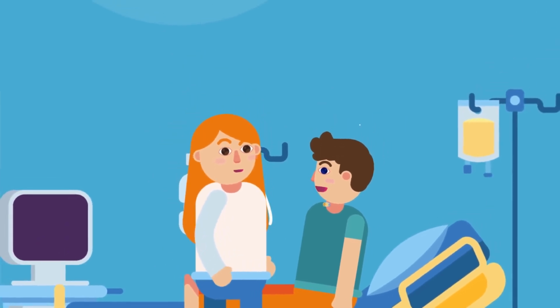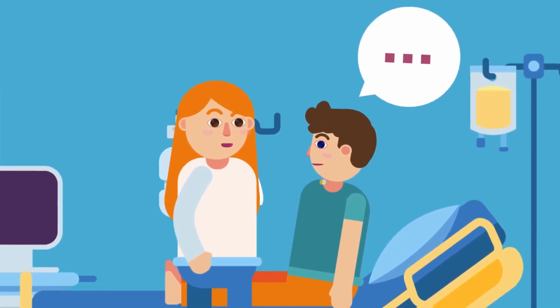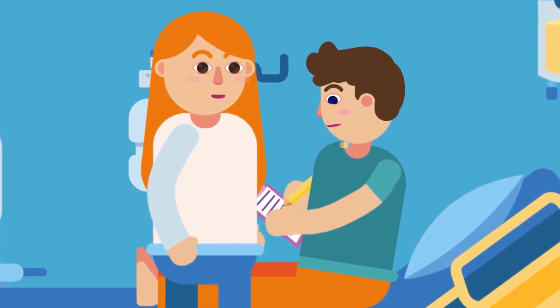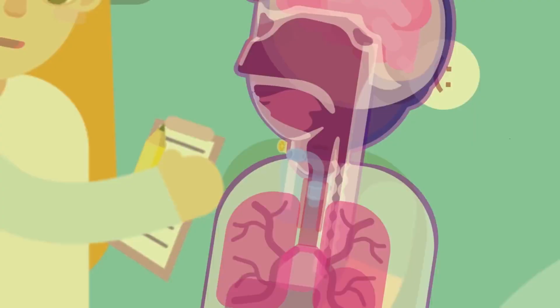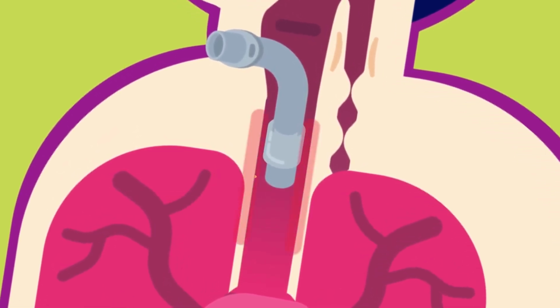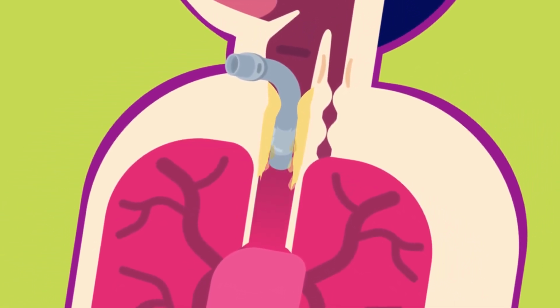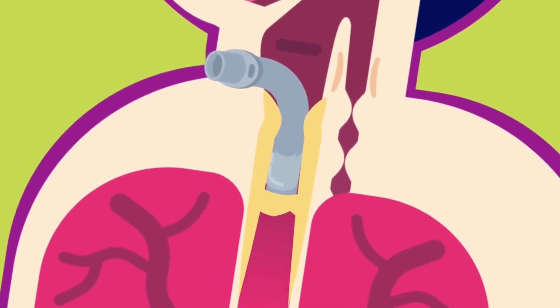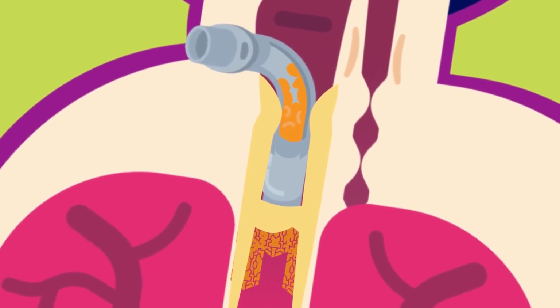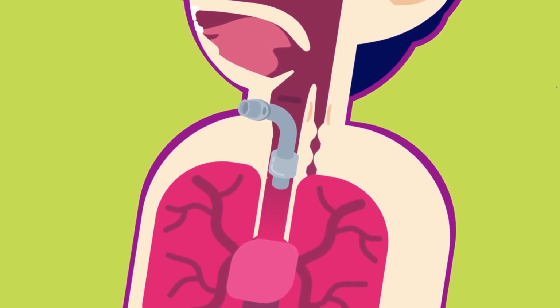Since the tracheostomy forces the air to bypass the vocal cords, patients would not be able to speak effectively. In such cases, a notepad and bell should be provided to the patient to allow them to communicate effectively with their healthcare providers. Fourthly, if the patient has a cuffed tracheostomy in place, then the cuff should be deflated periodically to relieve pressure on the trachea. However, this may not be feasible in patients with increased risk of aspiration. In case the tracheostomy tube is damaged, infected, occluded, or non-functioning in any way, then a new tube should be inserted in place of the old one under expert supervision.